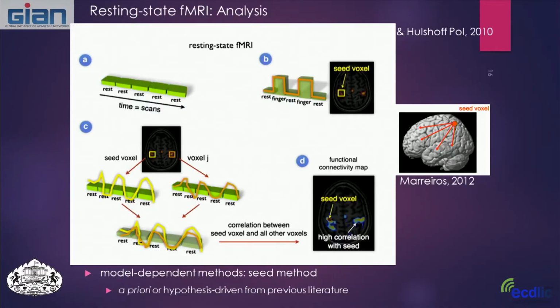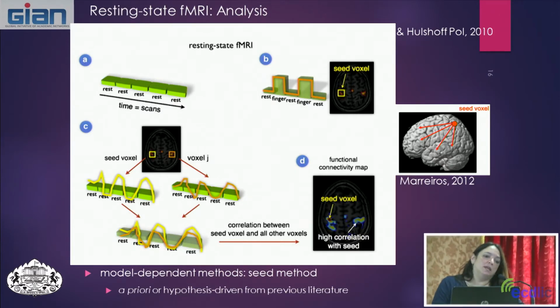So again, how are we going to measure which regions are active while this spontaneous bold is going on? And as I mentioned before, we do this with a seed voxel, and we do this by taking correlations with this seed voxel in different voxels in the brain over time. So here we go as an example. A shows this resting state fMRI that we might be doing. So we're not doing anything over time. We're just sitting there quietly and letting these scans take place.